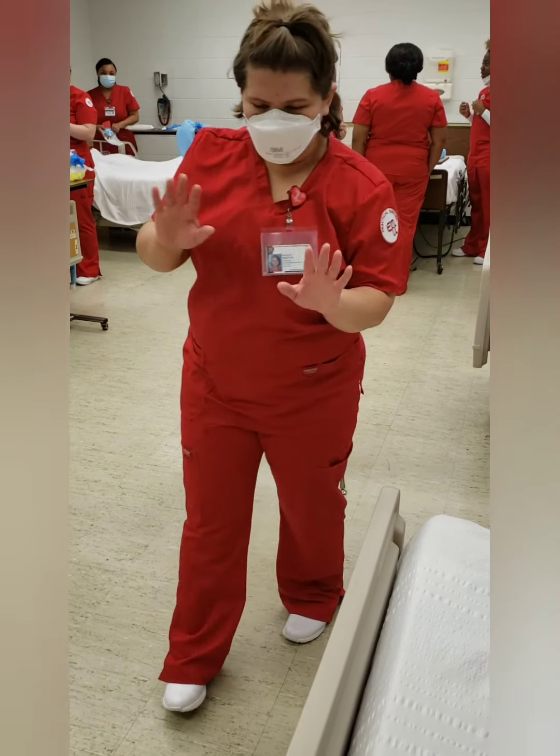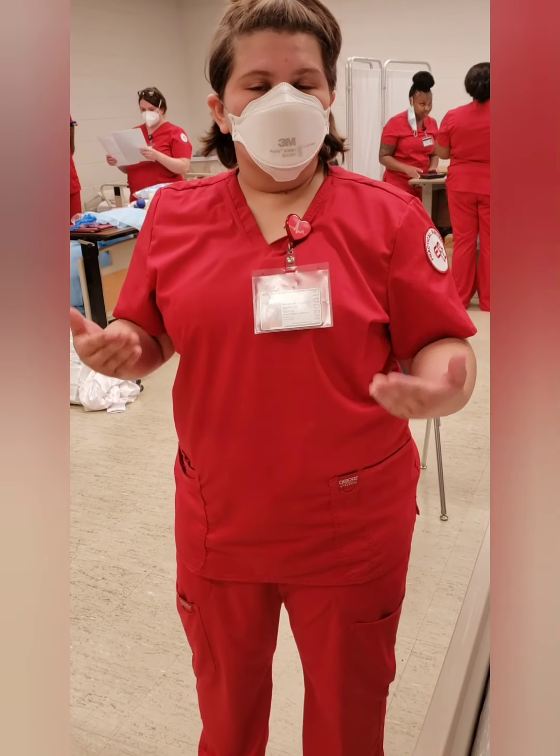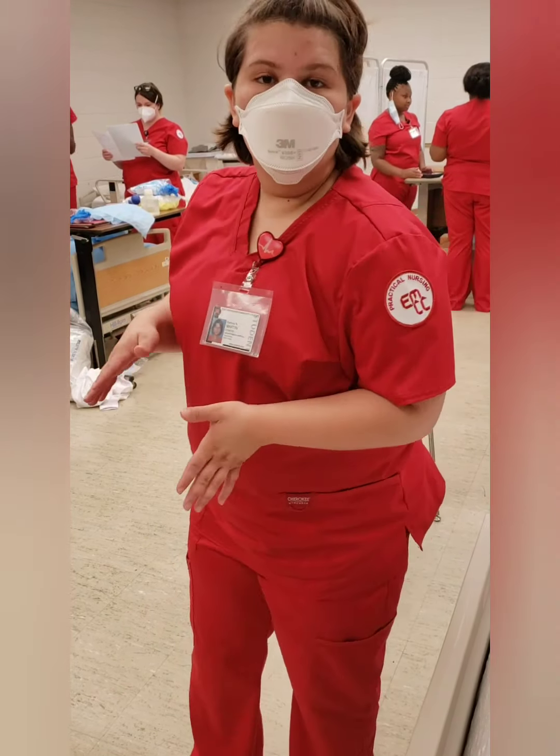Today we are going to do a wet to dry wound dressing for our patient. We have checked the patient's records and the doctor has ordered a dressing change to be done every 8 hours. I have ensured that the patient has no latex allergy, no microbial agent allergy, and no tape allergy. It is now time to change the patient's dressings and I will be demonstrating how to do so.